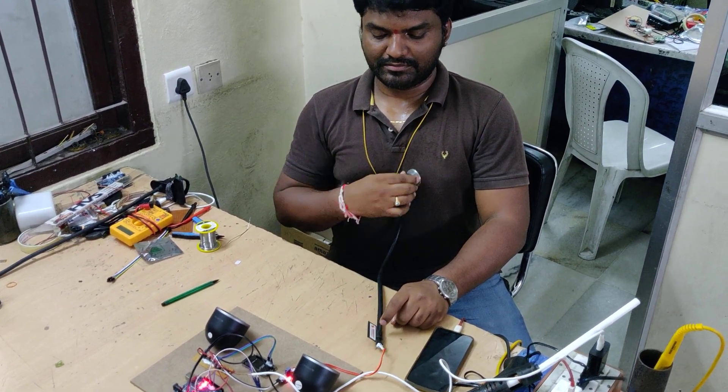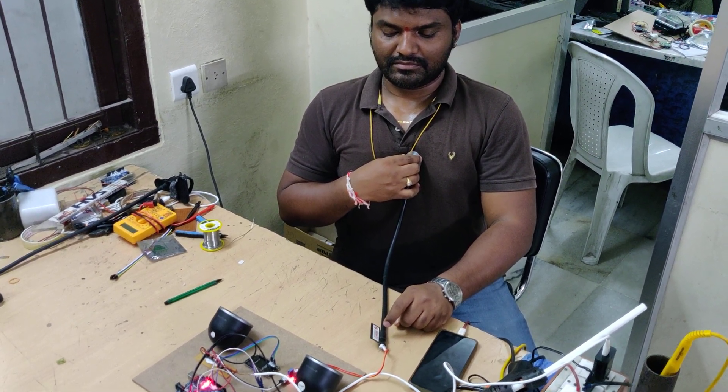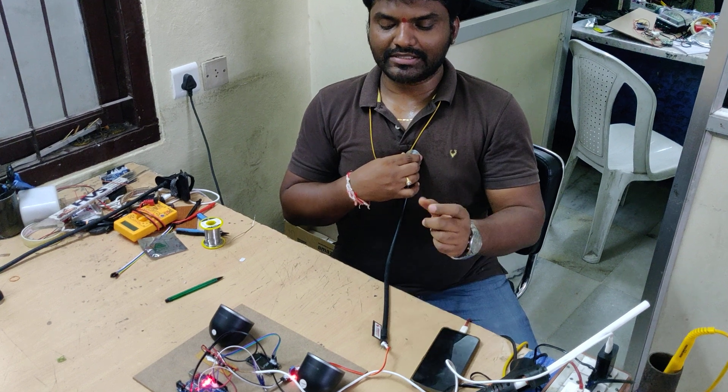Normal. Now it picks up — we can see it capturing the signal.